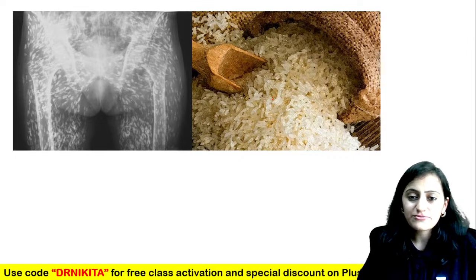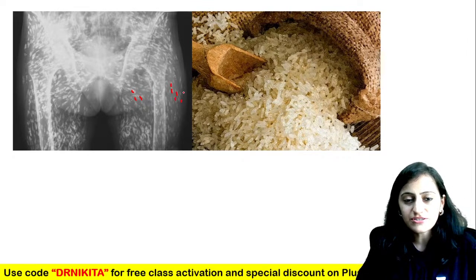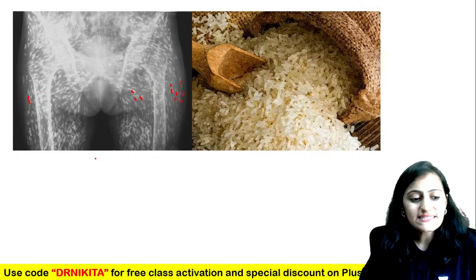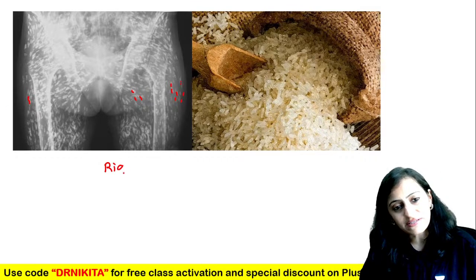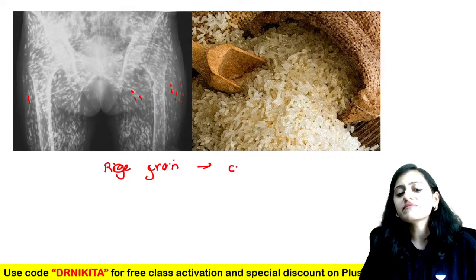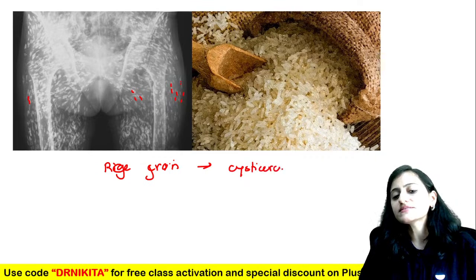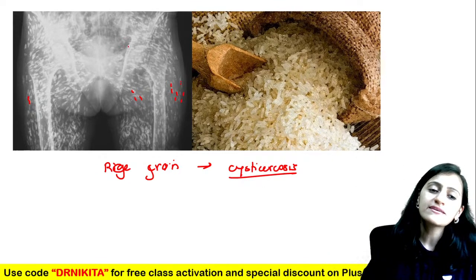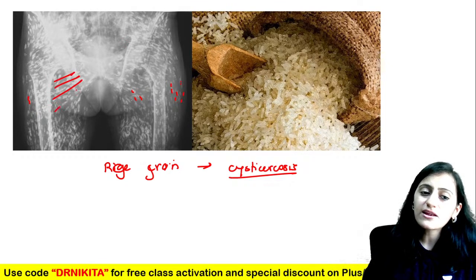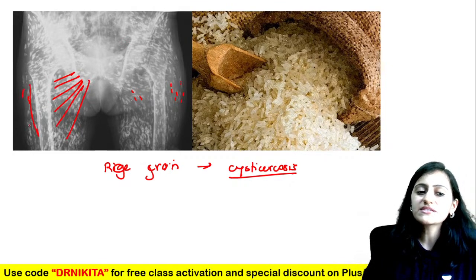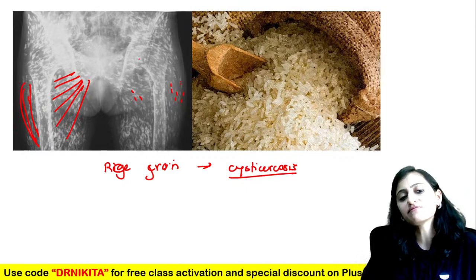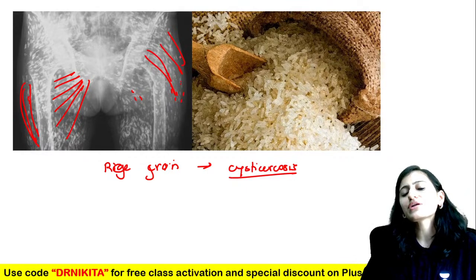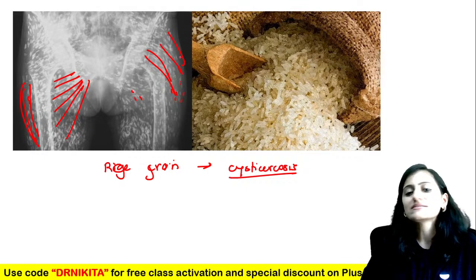Look at this rice grain calcification — that is the rice grain calcification seen with cysticercosis. When the parasite goes into the muscles it gets calcified. You can see the calcification is along the muscle fiber direction — that is your rice grain calcification in cysticercosis.